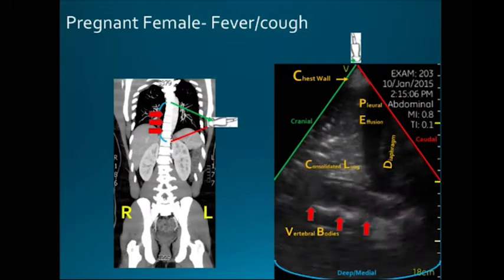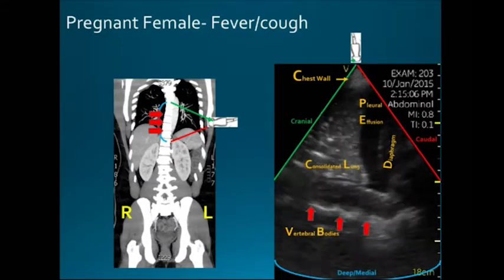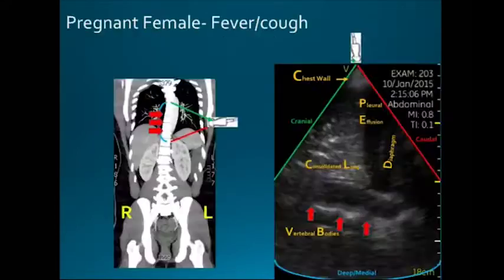And what's interesting is the CT on this read initially was she has some basilar atelectasis. And so this was an example where the lung ultrasound was actually better than the CT scan in this pregnant patient. And this can be done using the same exact probe that you use from an OBGYN standpoint. You can use this curvilinear probe and just essentially bring it up in the abdominal setting. You don't need a special preset or setting to do this.